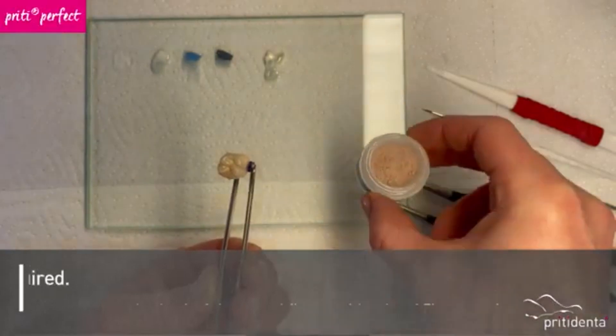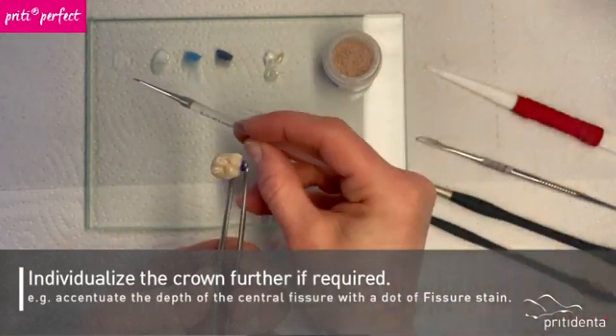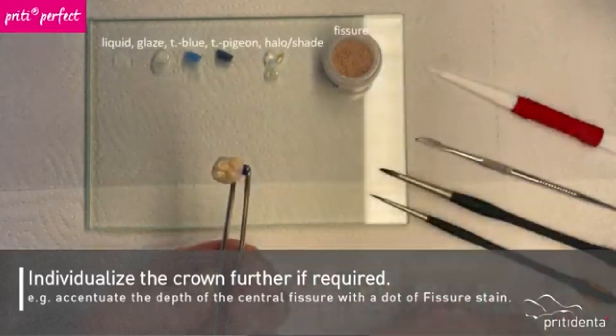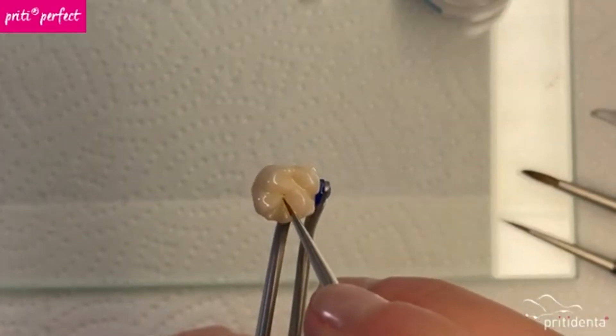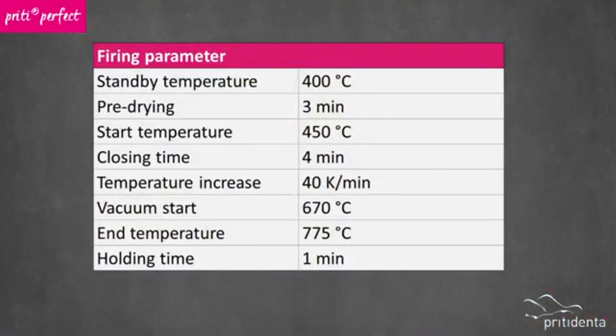Of course, you can now add more details. For example, I can't resist adding a tiny grain of our fissure powder to the deepest point of the central fissure. Now the crown can be fired. As every ceramic furnace is a little different, you may need to perform some trial firings beforehand to achieve a shiny but not over-fired surface. I check our furnace regularly with a silver test. It's pretty accurate and easy to use.